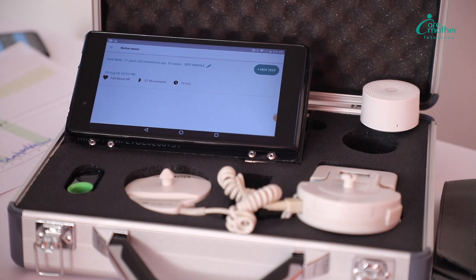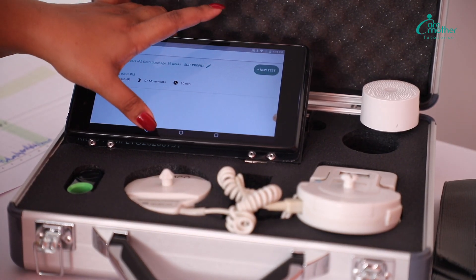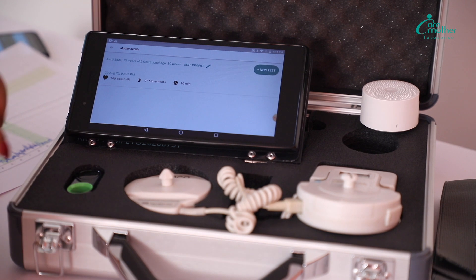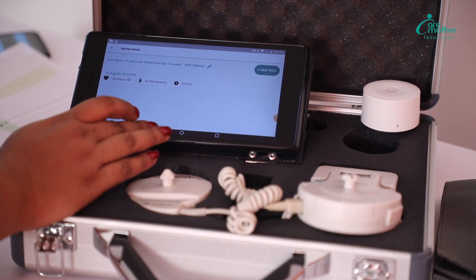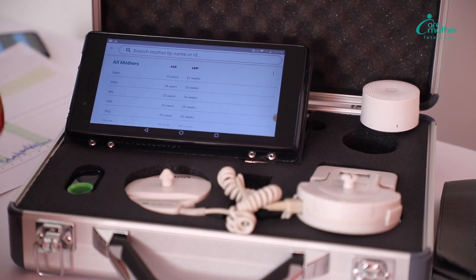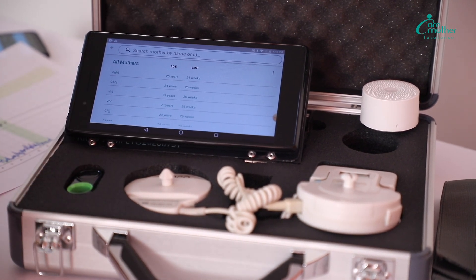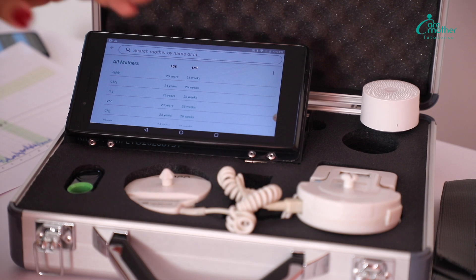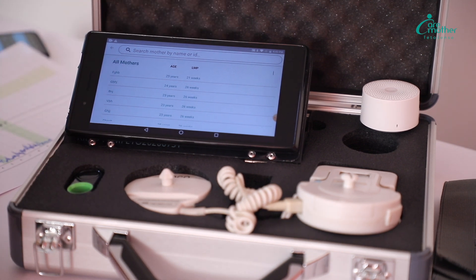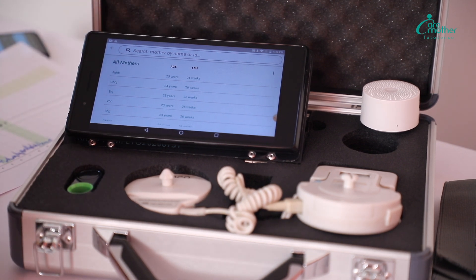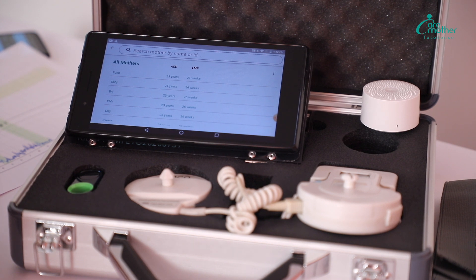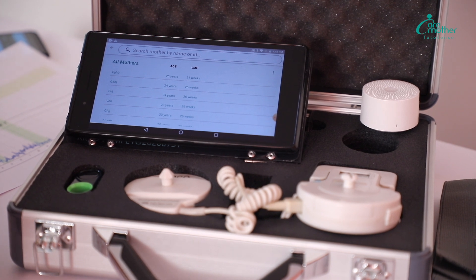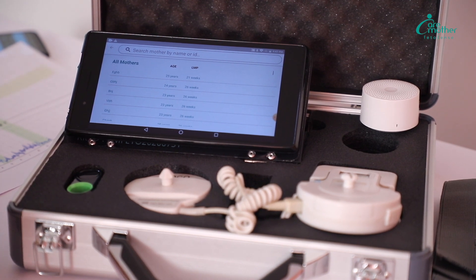To add to all of this, this device gives you the chance of being able to share the baby's heartbeat sound with the mother, which she can further share with the family. This enhances the whole patient experience and thus increases your patient engagement as well. Thank you.